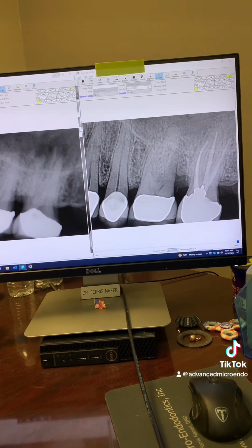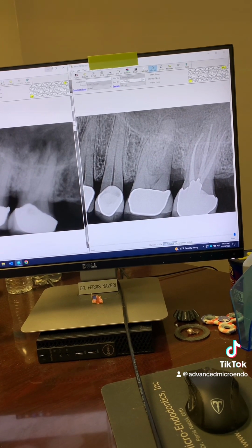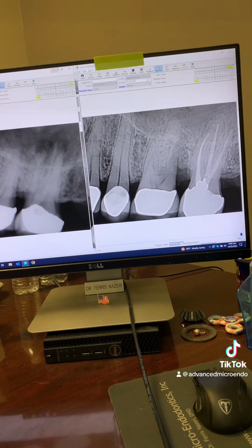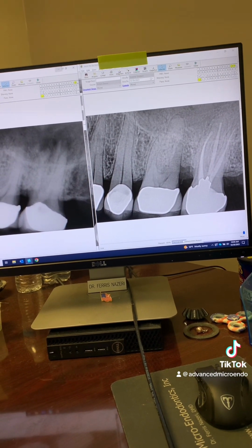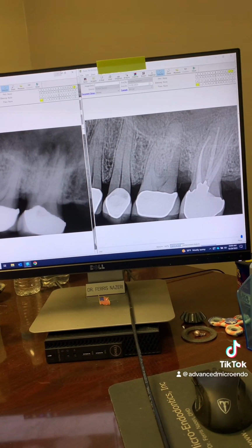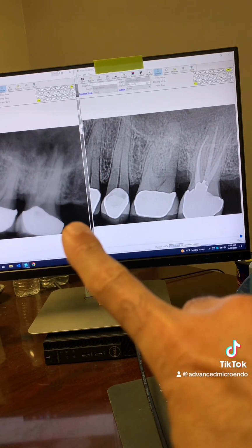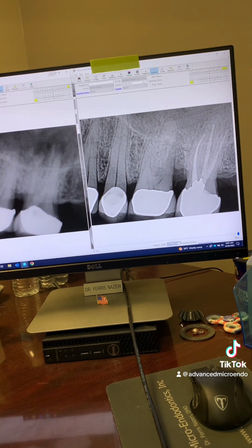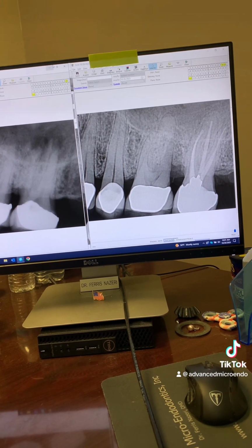10 years, 7 months post-op of tooth number 15. We did it in one appointment. Again, root canal therapy, root canal treatment, or endodontic retreatment doesn't have to be multiple appointments. One appointment is good, even better than multiple appointments. And this patient had a buccal sinus tract too when we did the root canal in one appointment. So patient could have swelling, sinus tract, what have you.